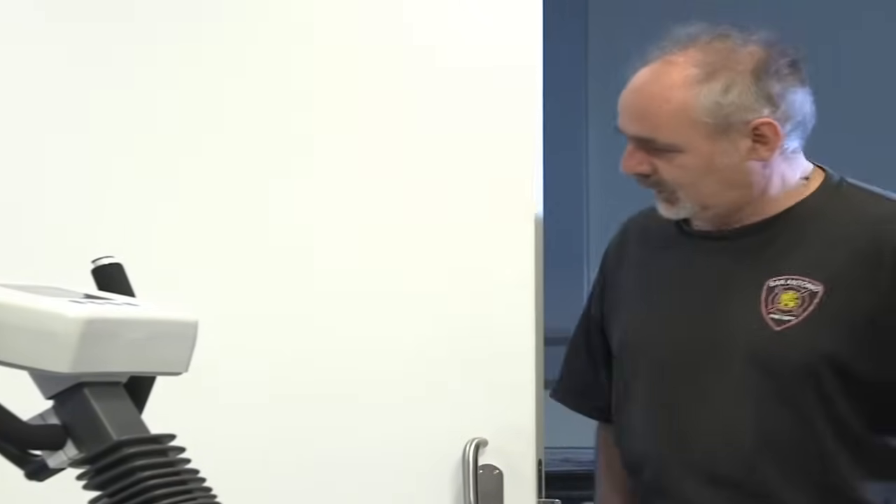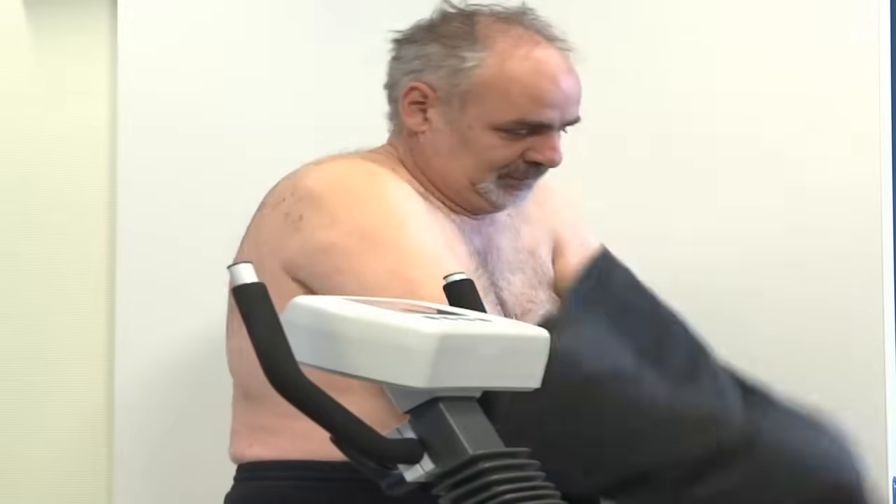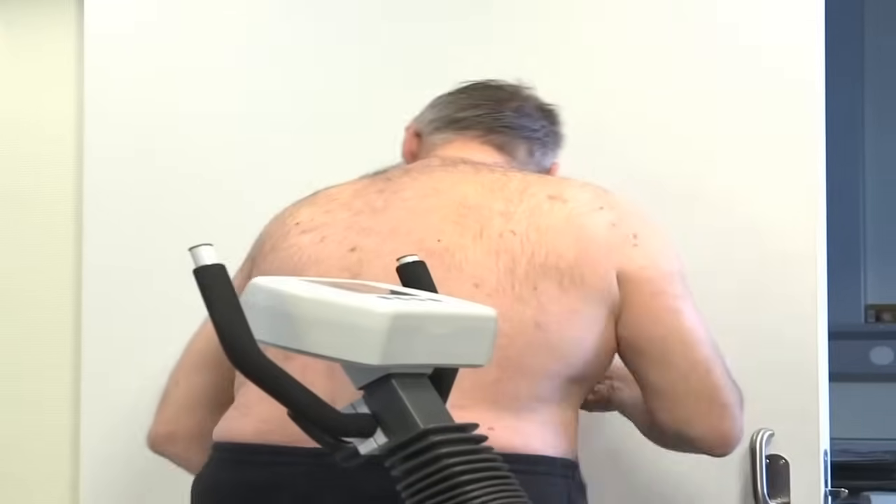Voici la salle de test d'effort. Je vous demande juste de vous allonger et de vous mettre torse nu. On va avoir besoin de vous mettre des électrodes à la poitrine et puis ensuite on mettra une voie veineuse.